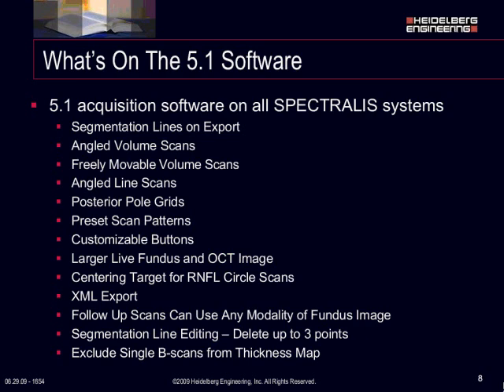You can also freely move the volume scans now. You can grab the center of the scan and you can move the volume scan wherever you want to within the HRA image. You can also angle the single line scans.